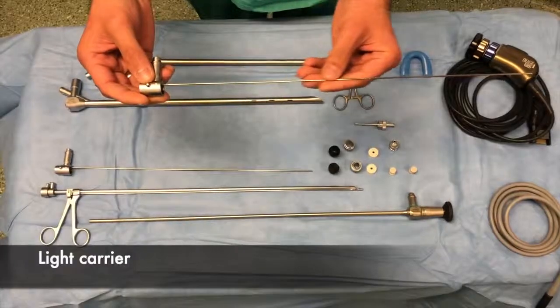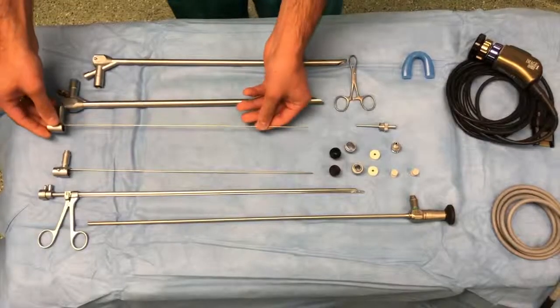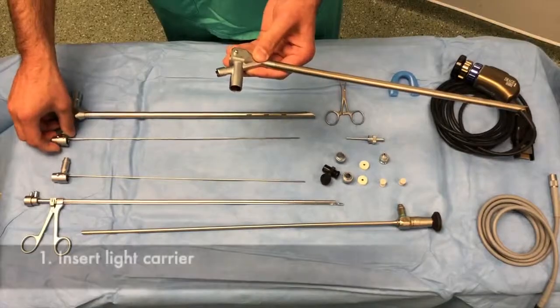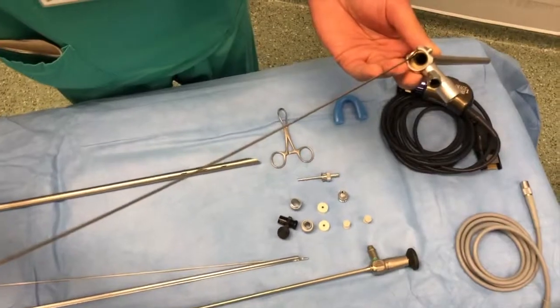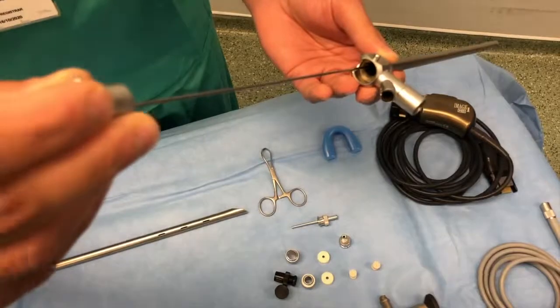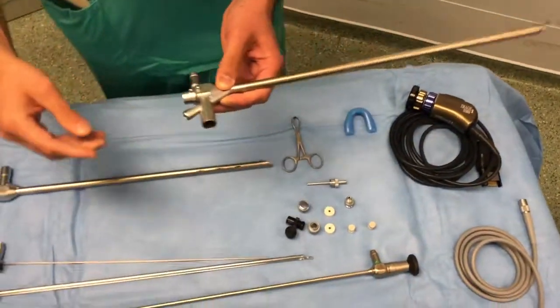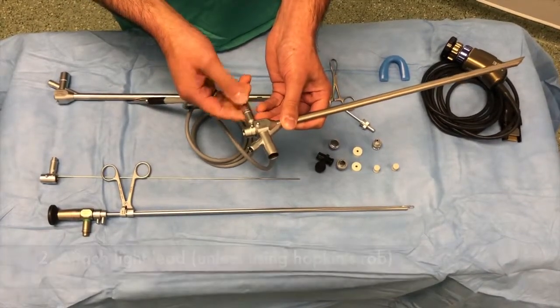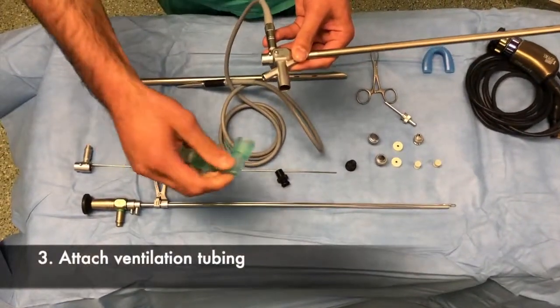This is the light carrier. These are optical grasping forceps that can be used to remove foreign bodies. First, the light carrier must be inserted along a port on the inside in this lumen as shown here. The light carrier clicks into place and does not move. A light lead can then be attached if the operator is planning on inserting the Rigid Bronchoscope under direct vision rather than using a camera.